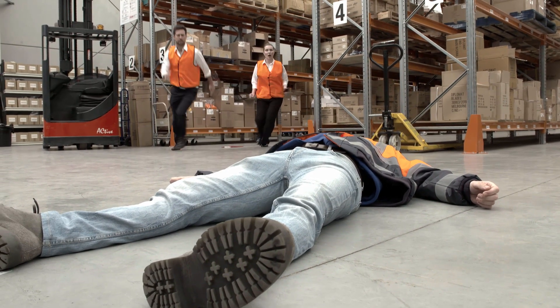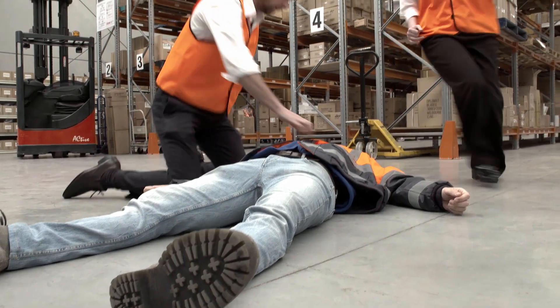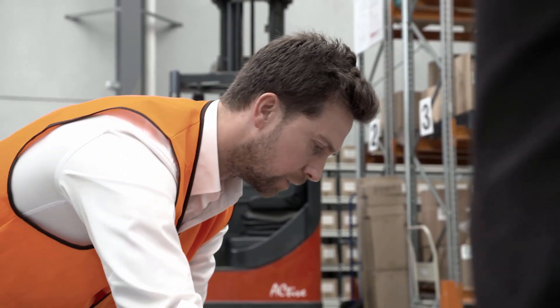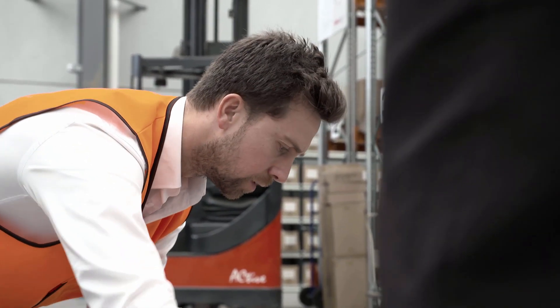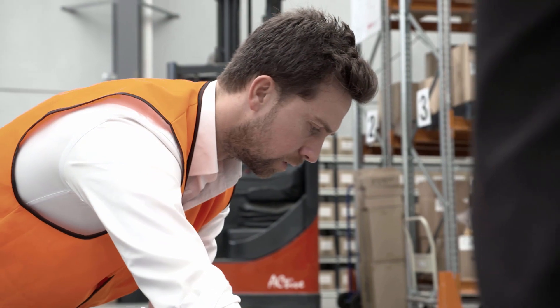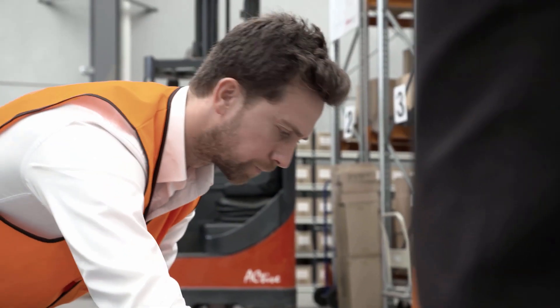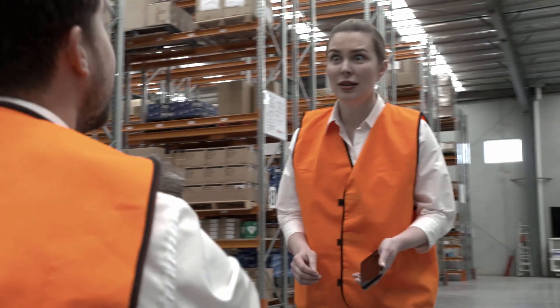Check the patient's response to talk and touch. Touch or tap on the patient's cheek and ask if they are okay. If there is no response, call Triple O Ambulance. In the scenario shown: 'Beth, call Triple O and get the defib.'